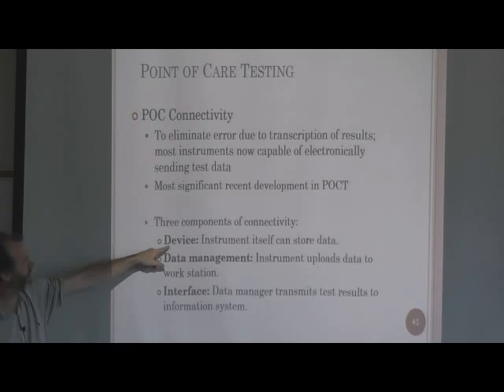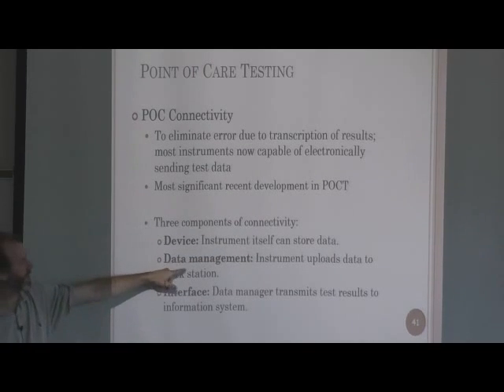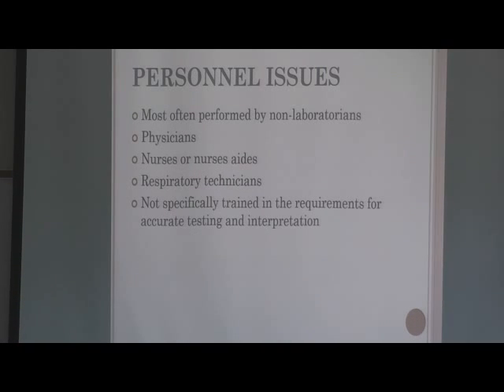There are 3 components to connectivity. The device itself, the instrument itself, can store the data. Then a data management system uploads the data to a workstation or interface, where the data manager transmits test results to the laboratory information system. So personnel issues with point-of-care devices: most often they're performed by people who aren't laboratory personnel, where it's still the laboratory that's responsible for all the point-of-care testing. Does that make sense? So what do you think you have to do?